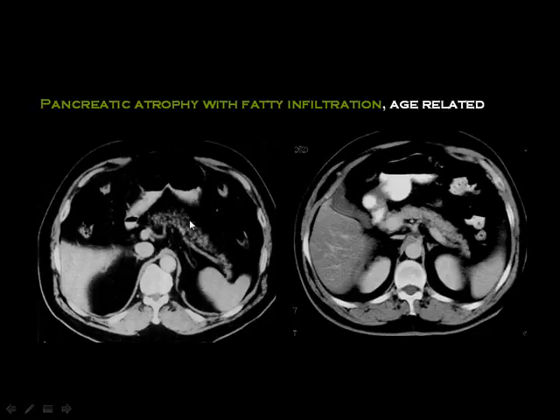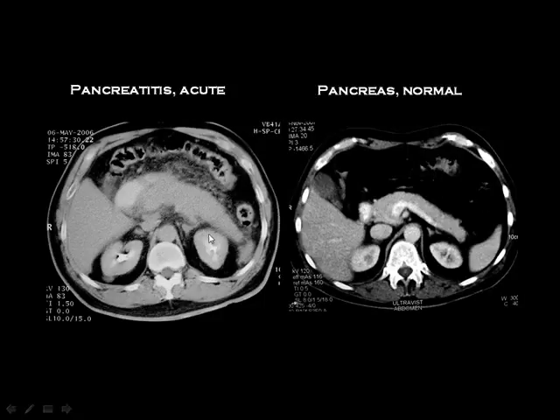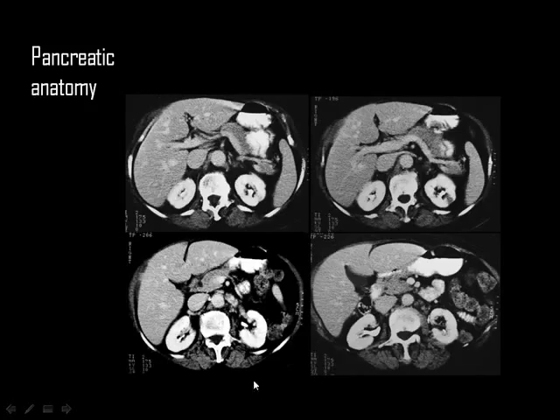The pancreas is often infiltrated by fat in elderly patients, which is considered normal and has no relation to pancreatic function. In normal cases the pancreas has clear fat around it, but in acute pancreatitis the pancreas is swollen and the surrounding fat is congested — appearing dirty with opacities representing congested inflammatory veins.